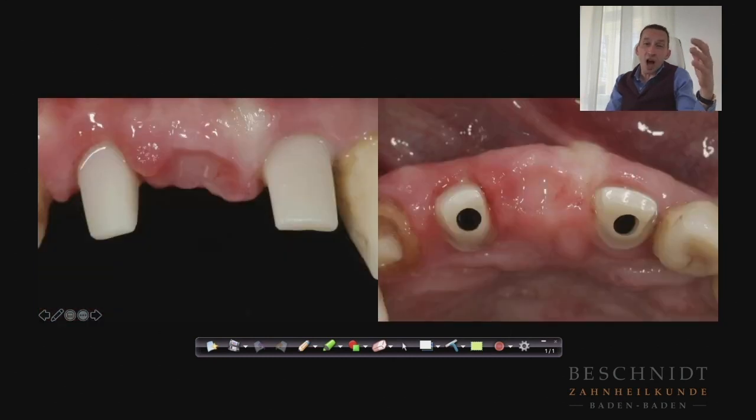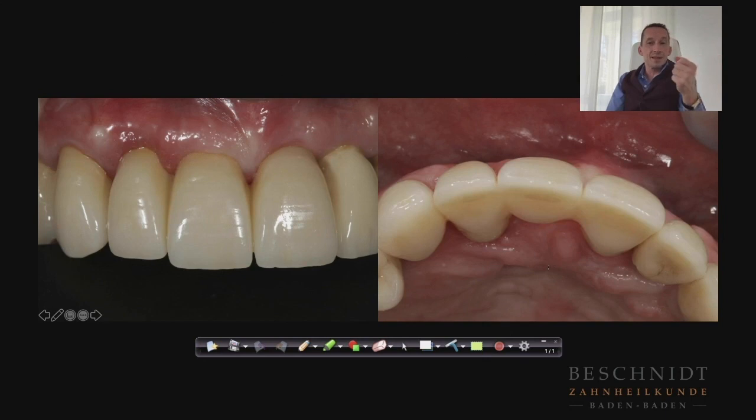We didn't screw out the abutment anymore, which means we have a nicely healed wound around the abutment, and now the abutment implant interface beyond bony level serves as a one-piece implant. We don't have a gap open to the oral cavity. And this is the final all-ceramic bridge.